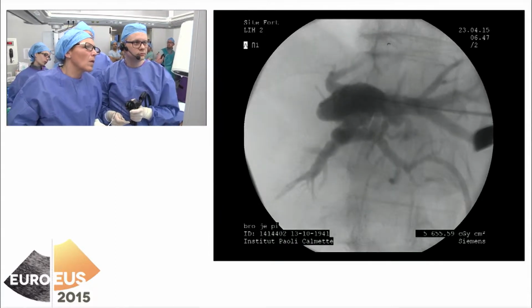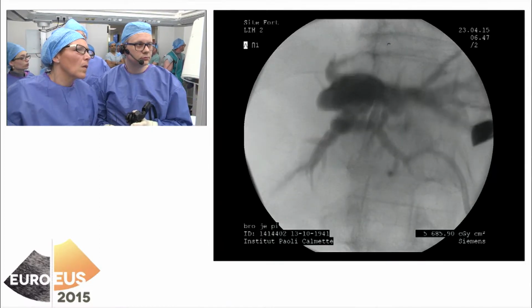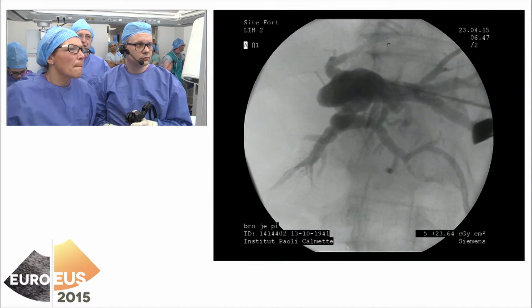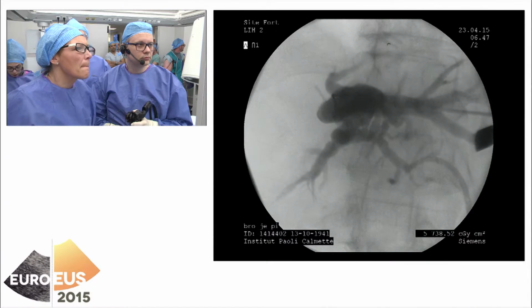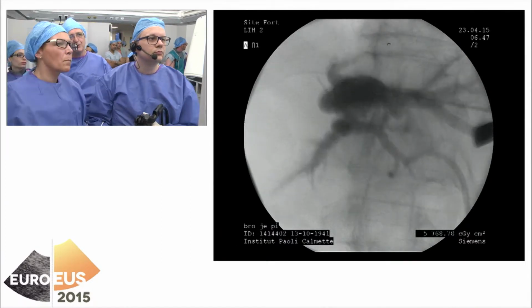or to start again, having the possibility to inject there, leaving a catheter, and start again an ERCP, knowing that we will have the opacification on both sides, and that it may help in finding this tiny communication.